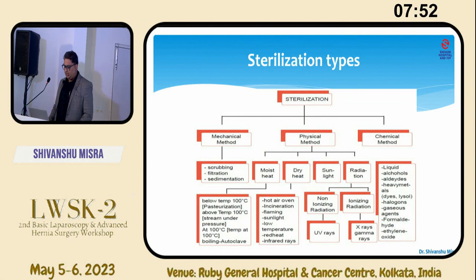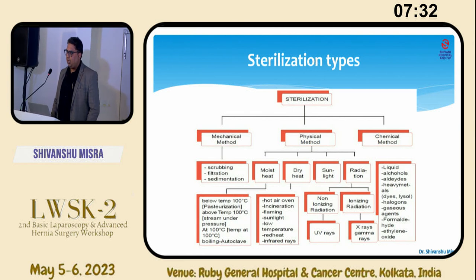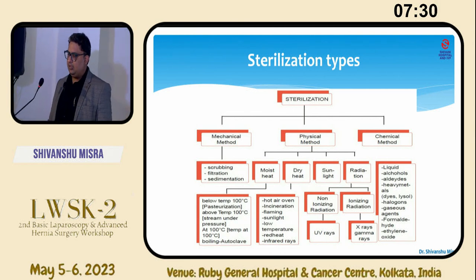One is the mechanical method, then the physical method, and the chemical method. The mechanical method is simply scrubbing and filtration, sedimentation, and the physical methods combine heat, moist heat, dry heat, sunlight and radiation. I know it's quite a dry topic and everybody would be aware of that, but it's my job to bring forth these important things and what you should carry toward your home. And moist heat can be below 100 degrees centigrade, at 100, and more than 100 degrees centigrade.